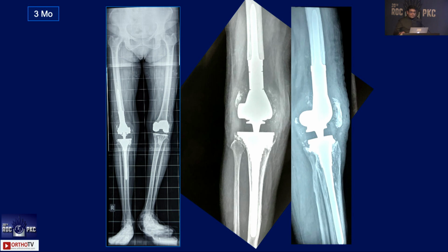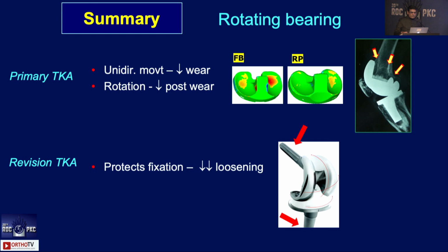Well, I think, and this you can have both. You can have uncemented, that's what this particular one is, but you could use it in a fully cemented manner this time. I think let's skip that.